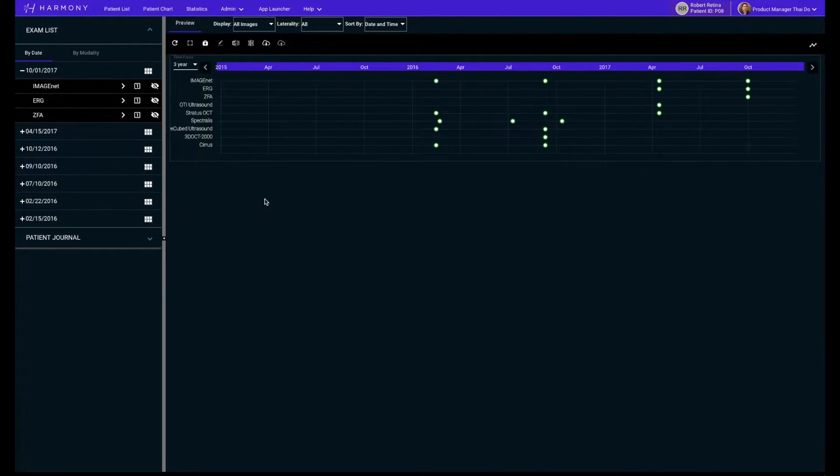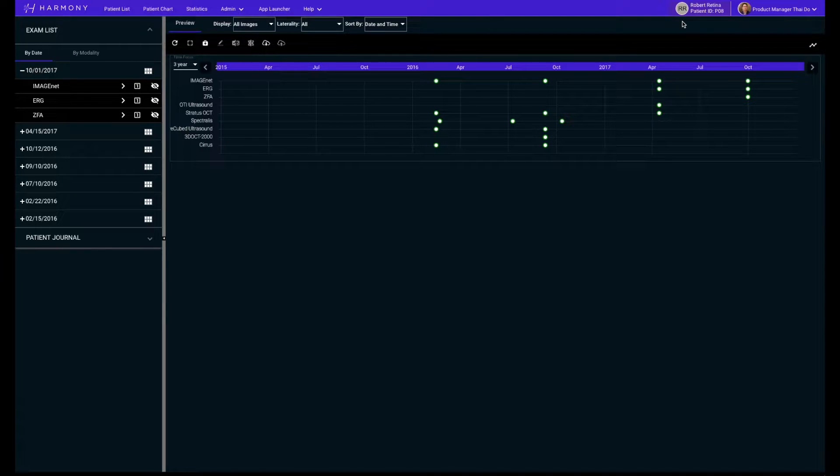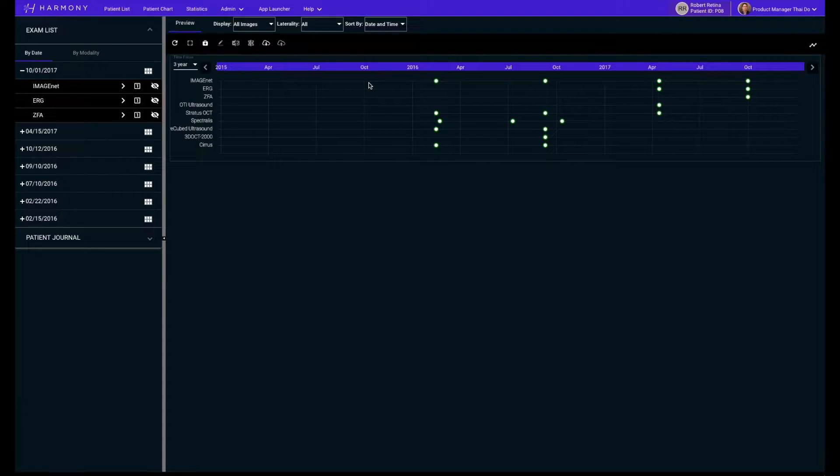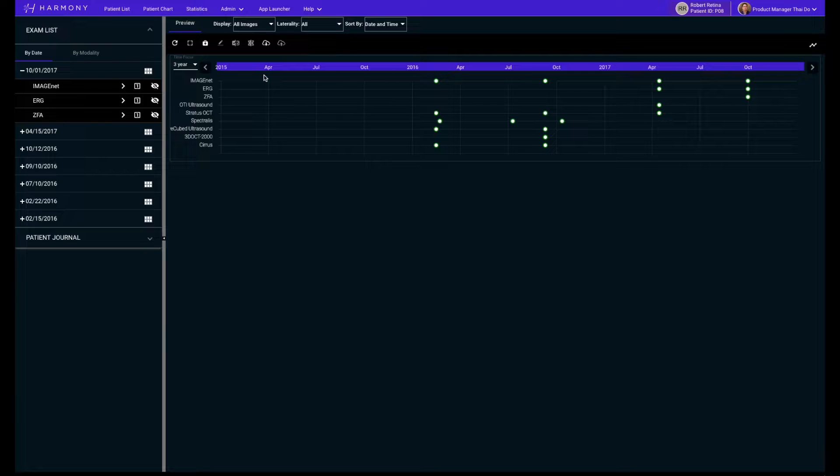Viewing your patient chart, the first thing you will notice is our brand new timeline graph feature. This new patent-pending feature for Harmony lets you visualize all of your data in a new, intuitive way. With a quick glance, you will know when and what images were taken for your patient's visit.